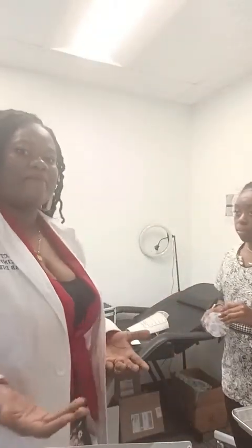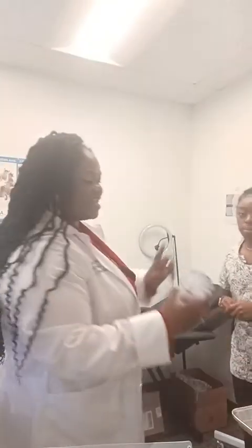Do not hand over the cup to them. And that is also because of the integrity of the test. Once the result comes back, we want to ensure that everything went properly from your end. They might be positive, and they might want to transfer those blames on you. So you want to make sure you do maintain the integrity of the test.